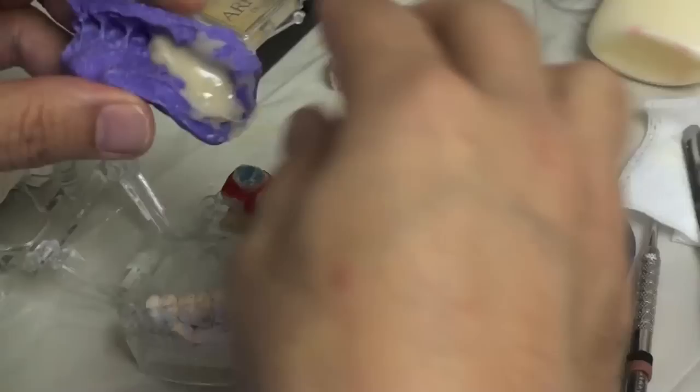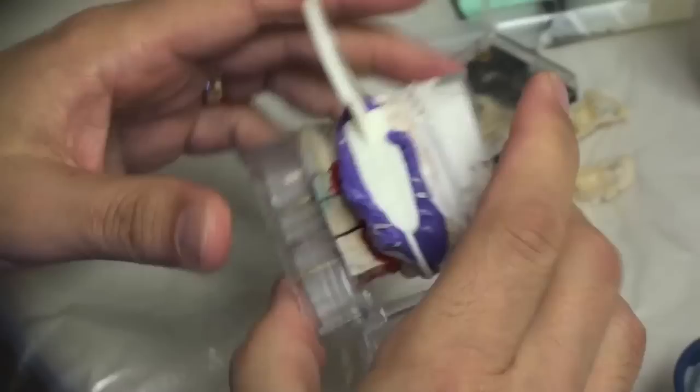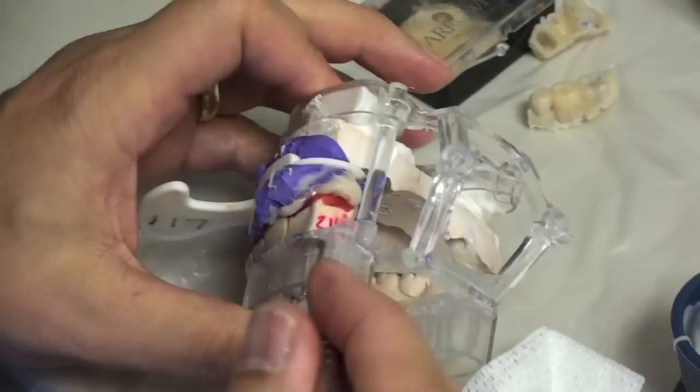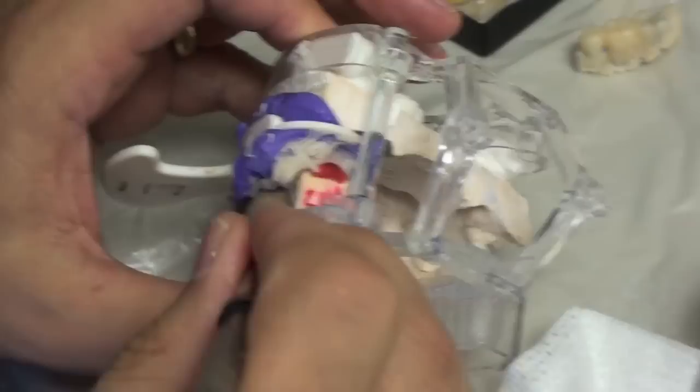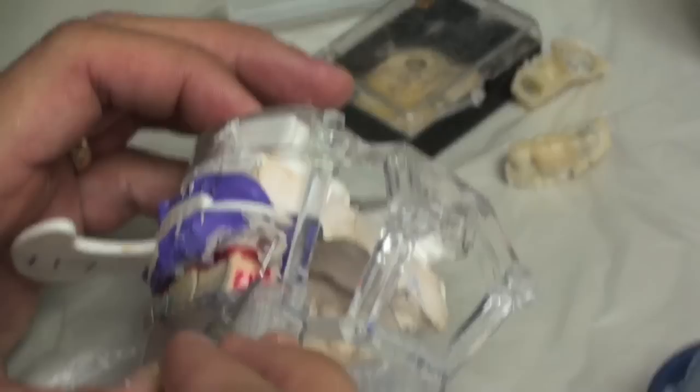Now I'm going to put it just like I would place it in the patient's mouth, making sure it's indexed correctly, and have the patient bite down into it. The stuff squishes out just like it would in their mouth. You can remove some of this excess because the more excess you have the more likely it is to lock in some place. The red wax is going to color the temporary but it's just an easy way to keep it from locking in.